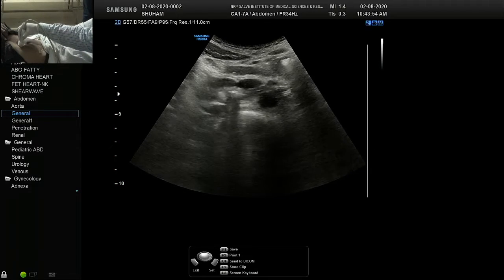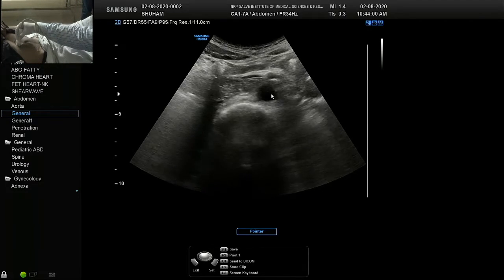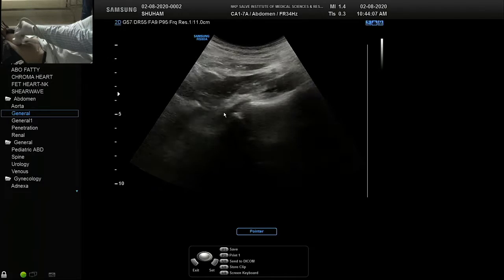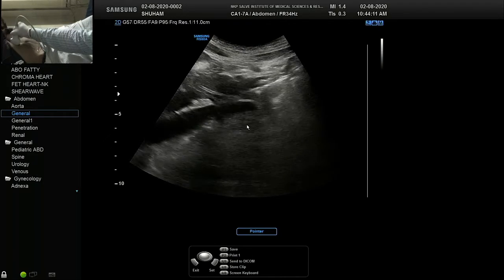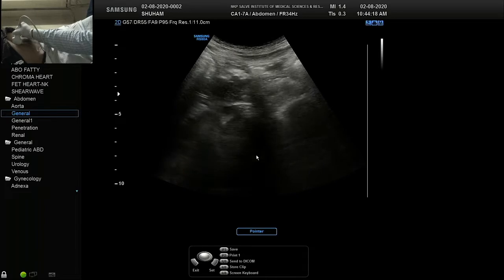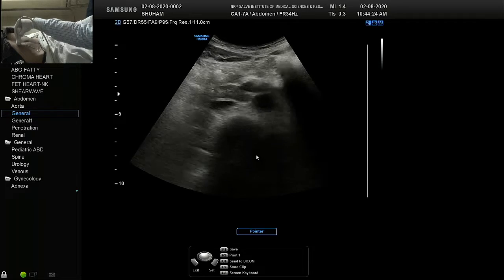See the vein how it is showing movement, that is the phasic movement, and this is the pulsatile movement. This helps us differentiate whenever there are occlusions in the other vessel. This is a vein, so make a long section here. That is the IVC. I have angulated the probe because I am putting here color Doppler to see it. And go down to the confluence of veins.